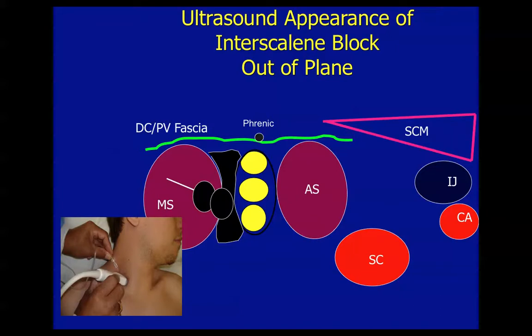It's very common for the initial appearance of local anesthetic to only be on the middle scalene side of the brachial plexus and for there not to be any apparent distribution on the anterior side. This is very common and still will result in a good block.